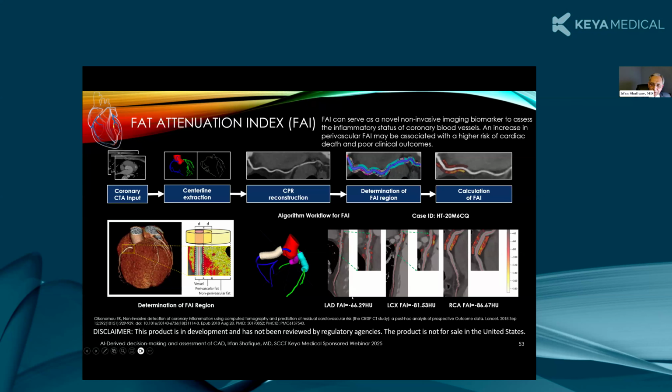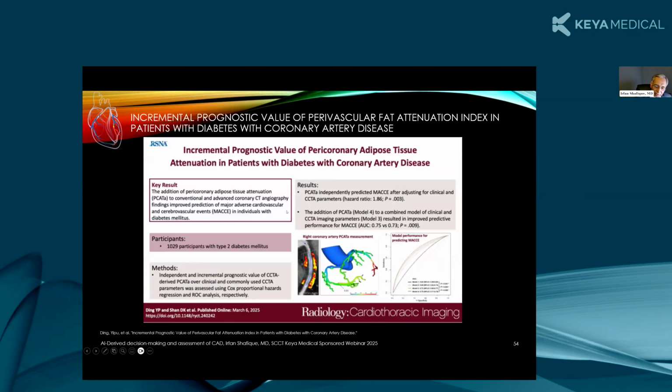As you can see, it's been measuring it. So they say a value higher than -70 is significant. It really is. A lot of studies are coming out on how you do it. And this just came out fresh from last week, actually a week ago.